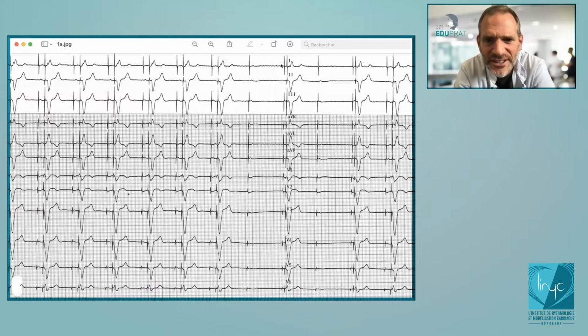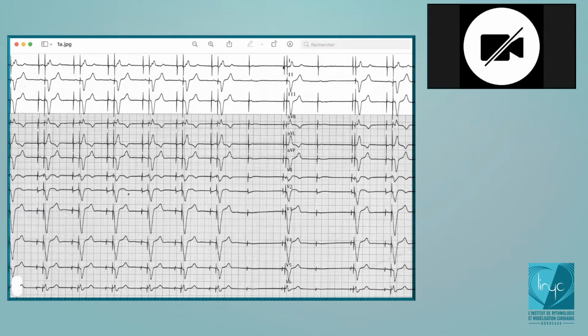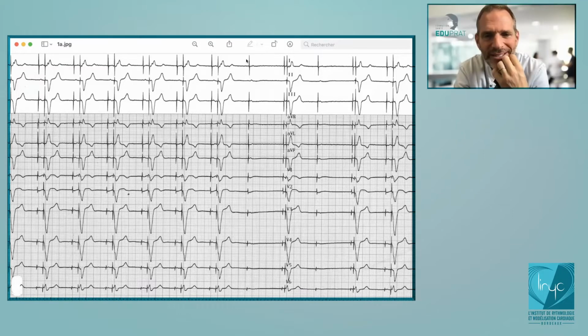Okay, so how is the AV interval here? The duration of the AV interval, do you know? 80 milliseconds. It is 80 milliseconds. So if I understand, paced atrial, blocked, then you pace the atrium, and then you will pace with backup pacing at 80 milliseconds. Okay? Okay.